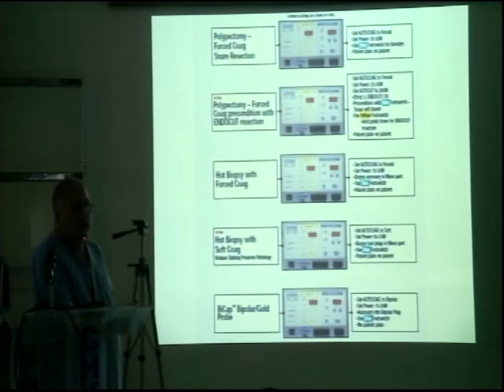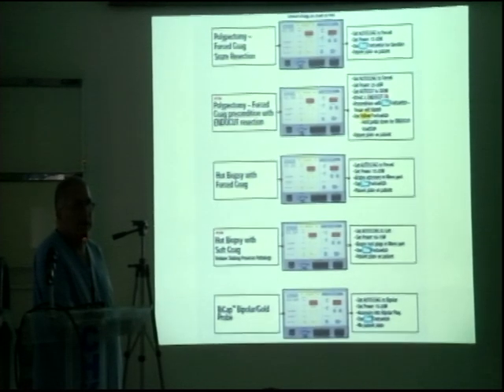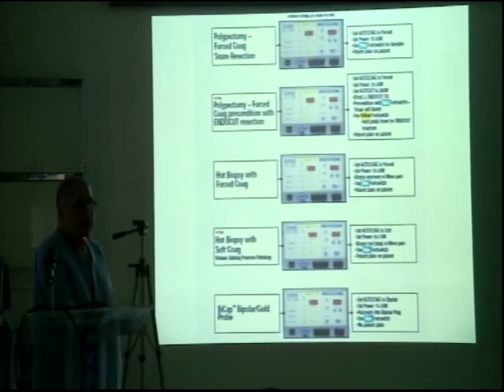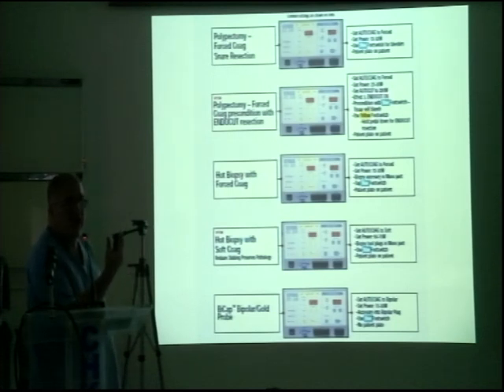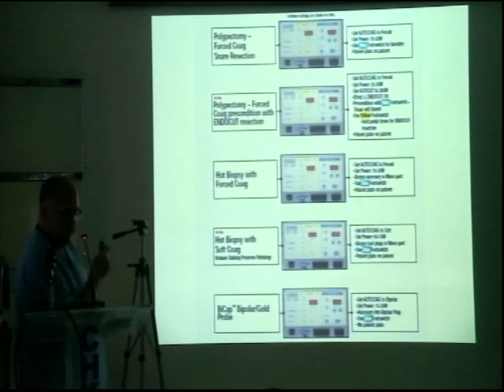Understand your coag, because if you don't, you shouldn't be pressing your pedal. Understand your equipment, because if you don't, you shouldn't be pressing the pedal. And also be aware that the person doing the closing of the snare can actually cause you a complication if they don't do exactly what you're asking. When you assess a snare, have the snare opened, closed, and then open slowly so it just appears, and then mark the proximal part of the handle which is going away. That then gives you an idea of how much stalk or polyp is in the snare itself. Okay?